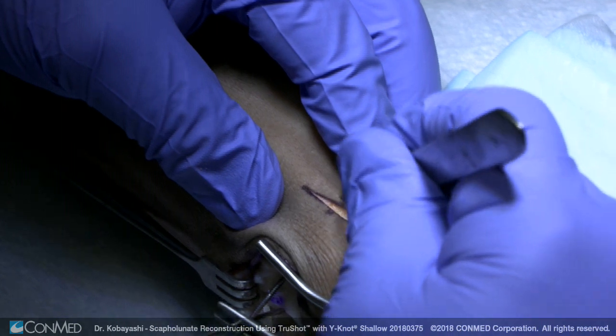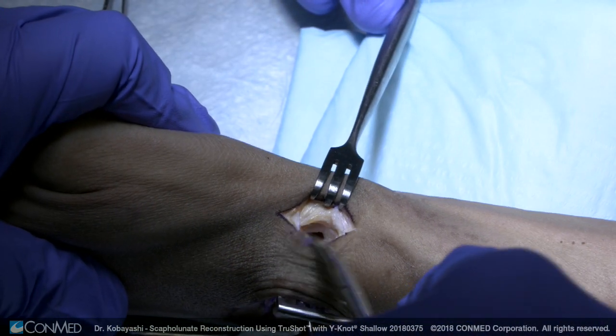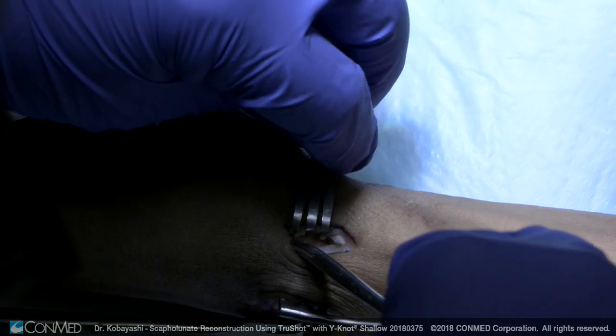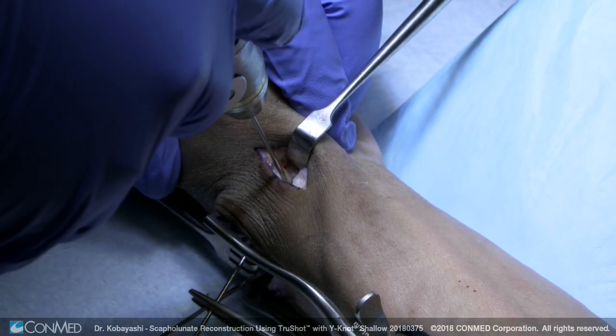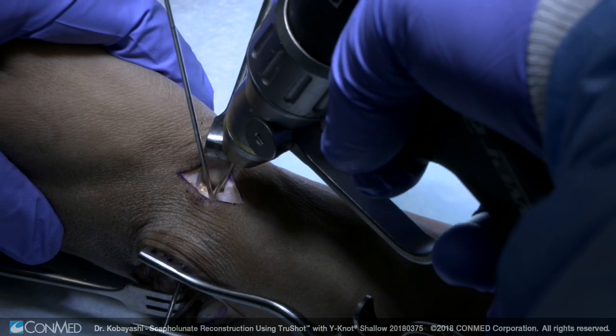I usually make a small incision here. You don't have to, but I think it protects the superficial branch of the radial nerve. Here you can see the styloid there. Some people will do a styloidectomy, but here's the scaphoid right here at the base, and I'll typically put quite a few K-wires — one from the scaphoid to lunate, one from the scaphoid to the capitate.